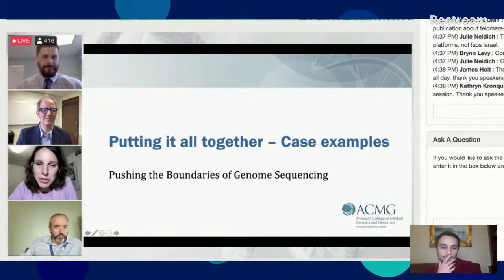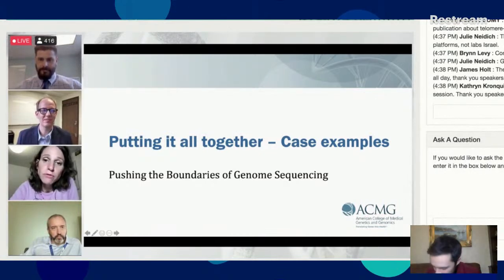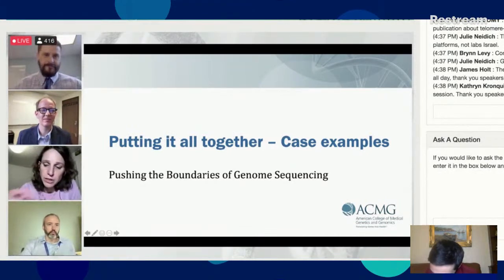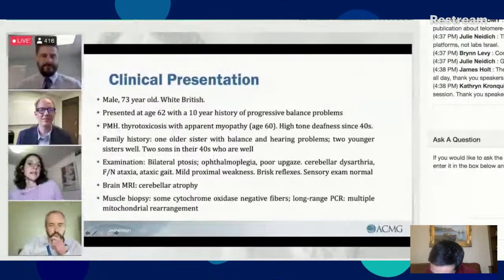Yeah, thank you very much. So we've got a couple of cases really that illustrate the ability of genome sequencing to resolve complex clinical cases, but also how the limitations of whole genome sequencing can be addressed by newer technologies such as optical genome mapping and long-read sequencing. So on to the first case.